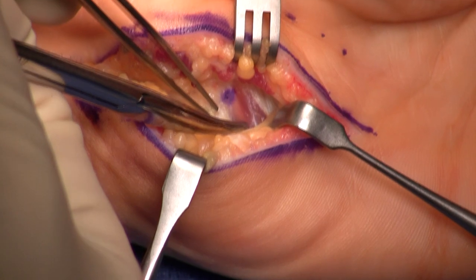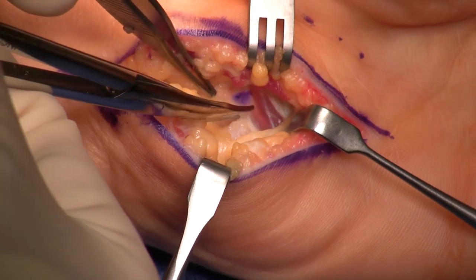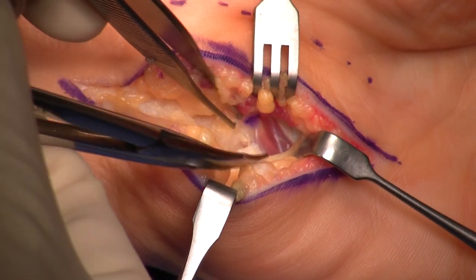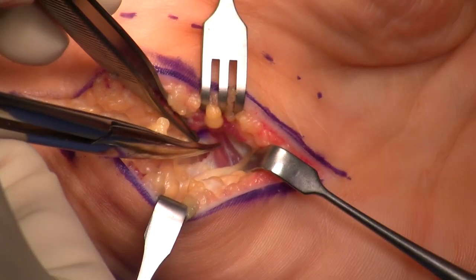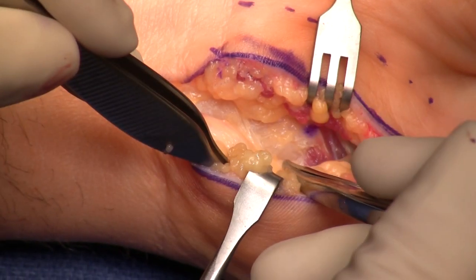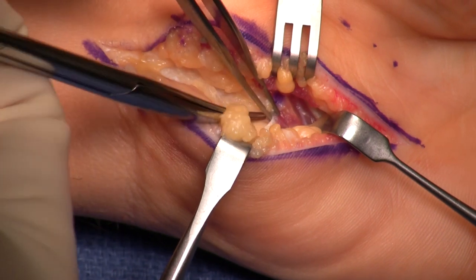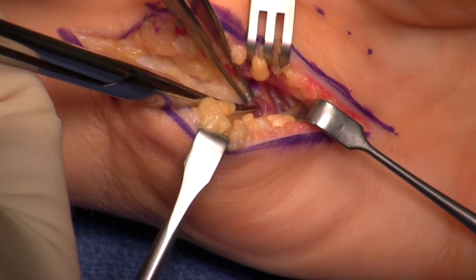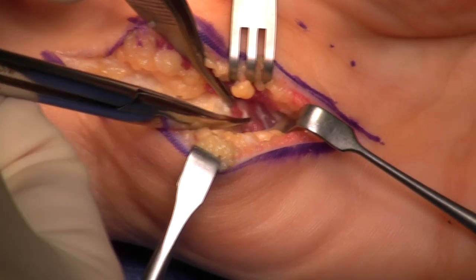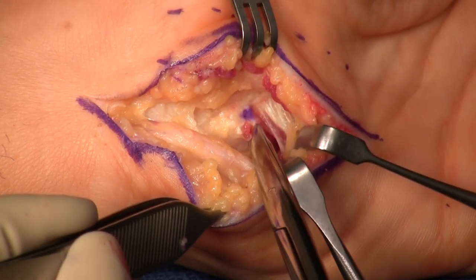I open up the hypothenar fascia here on the lateral side, as close to the hook of the hamate as possible. Once I decompress this tendinous leading edge, I'm going to see the deep motor branch. You actually have to do the decompression before you even really see the deep motor branch, so you need to have a specific goal in mind as to where to go. We're starting to see the deep motor branch coming into the exposure now, slowly picking away at the tendinous fascia at that leading edge.